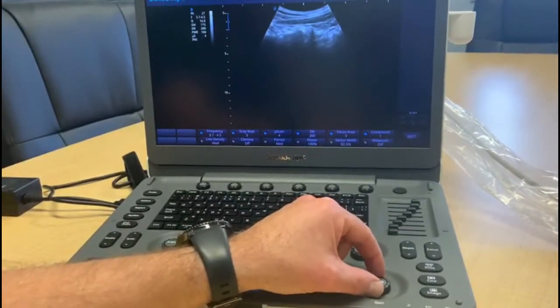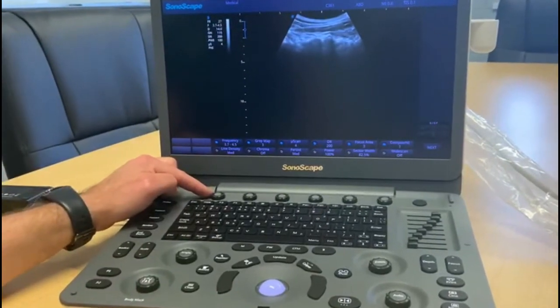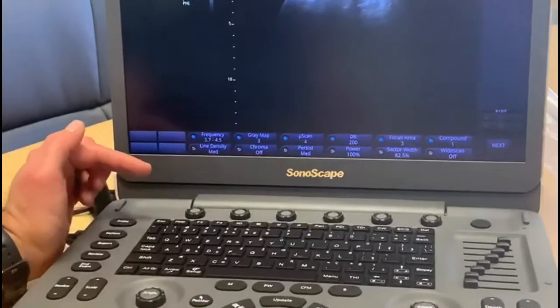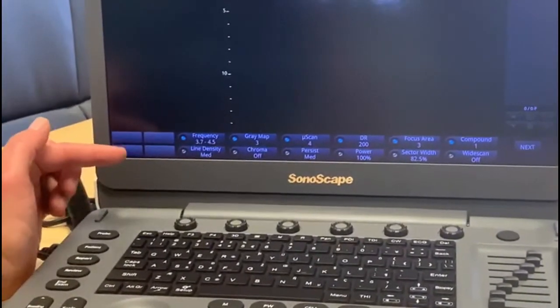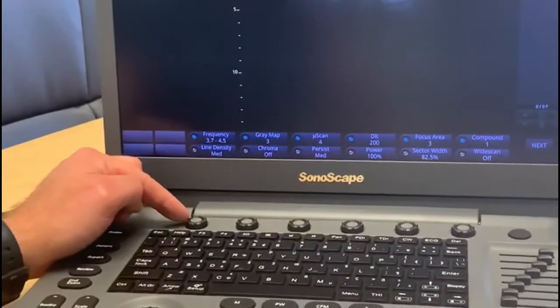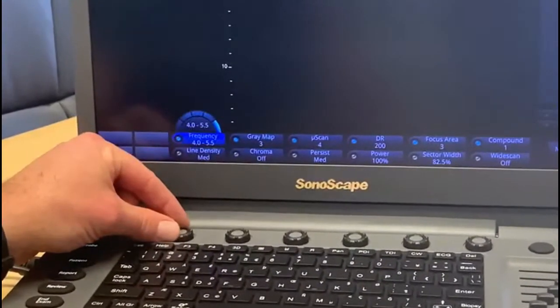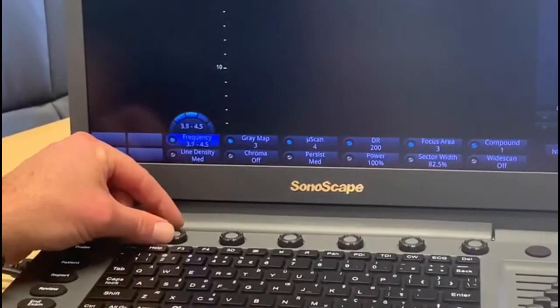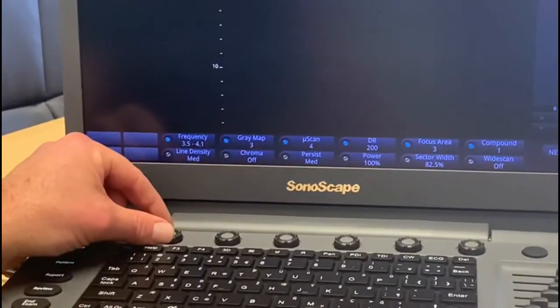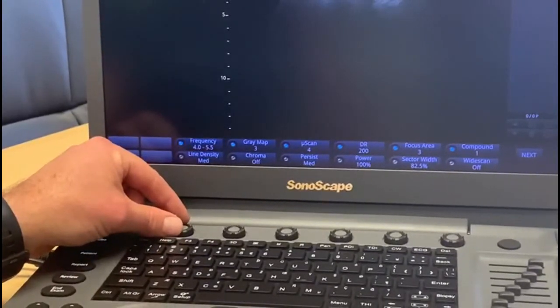The frequency button allows us to change the frequency of the probe. The lower the frequency, the deeper you're trying to image; a more superficial image will require a higher frequency. We can change the frequency using this dial, and you'll see it change as we adjust. This probe has a frequency range from 3.5 MHz up to 5.5 MHz. Since this is a superficial image, going to a higher frequency is appropriate here.